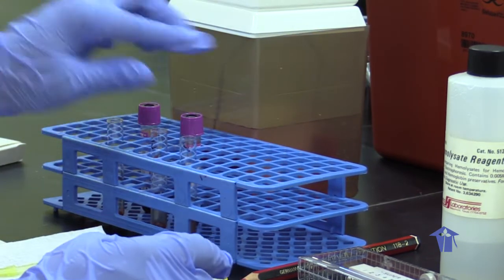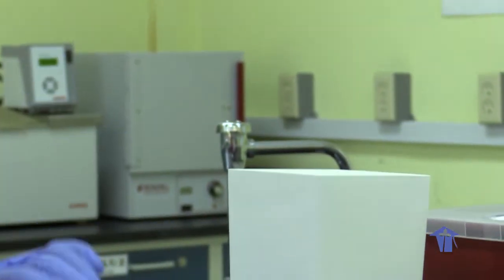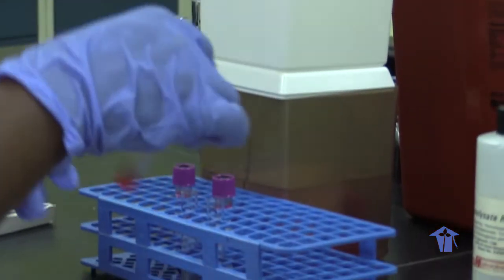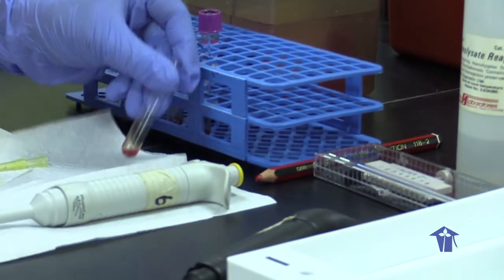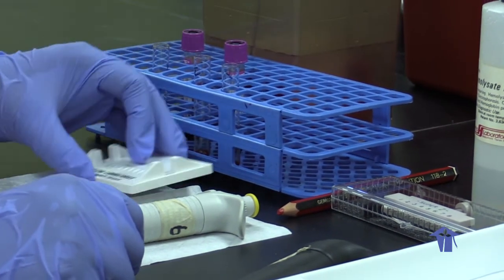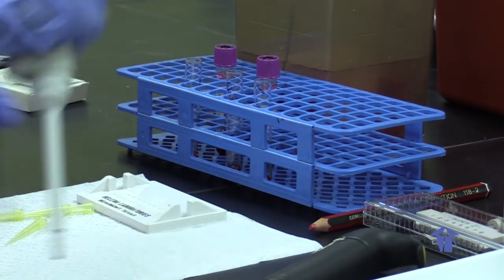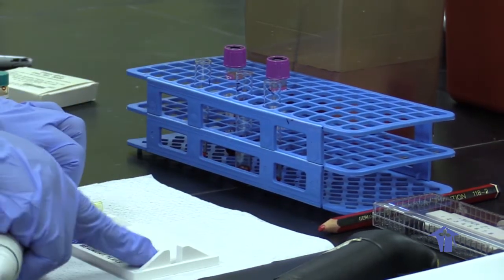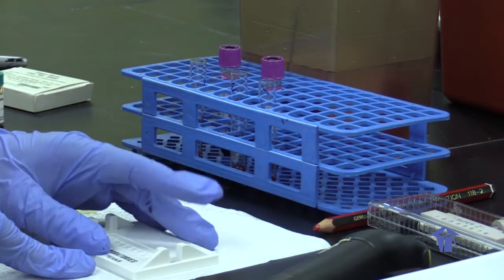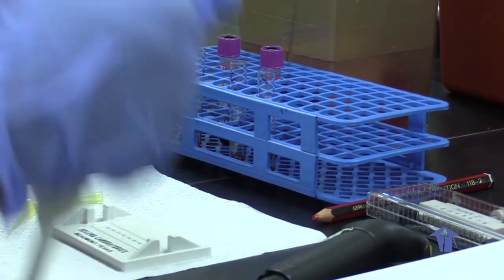So as you can see, it's immediately starting to lyse the sample. It's becoming like a bright cherry red in color. So already the hemoglobin is being released. Then we want to put it in the wells. This is where we place the blood sample and take them up to put them onto the plates.